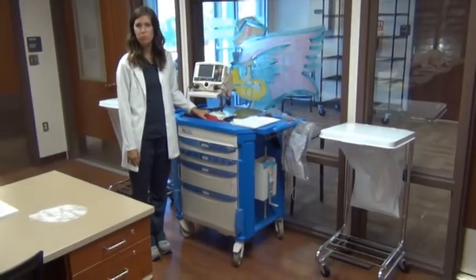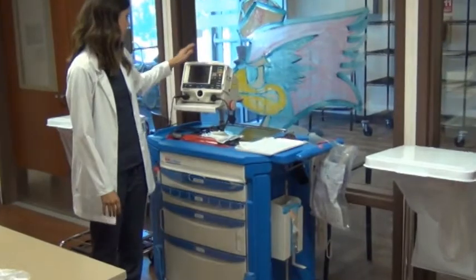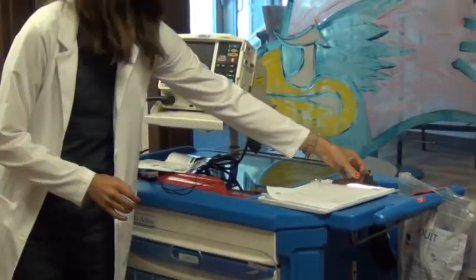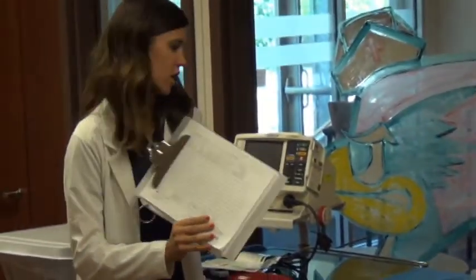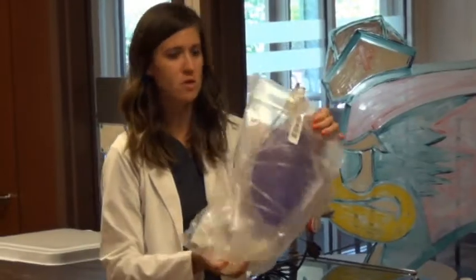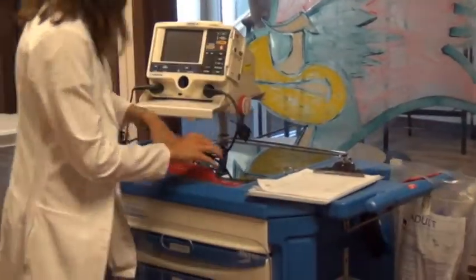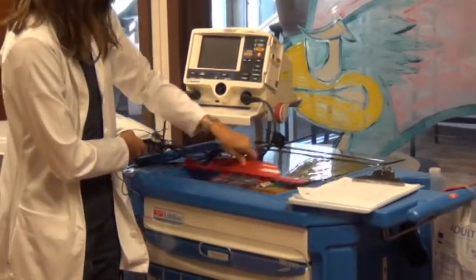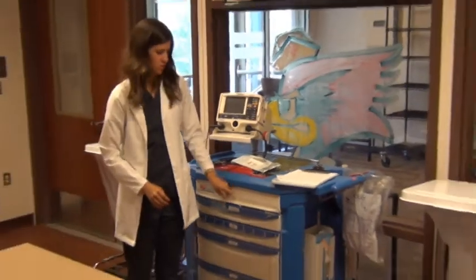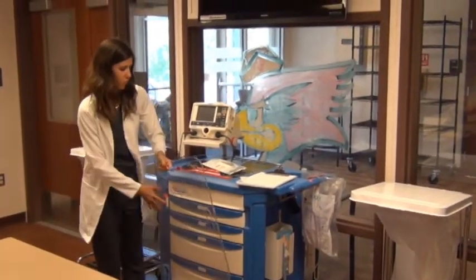In the event of a code blue, we have crash carts at either end of the sim hospital. On it, there is the defibrillator with pads, the code sheets that you would write all of your documentation on, the ambu bag for giving your rescue breaths, and all of the medications that you will need are in this top drawer of the crash cart. Once you roll the crash cart into your patient's room, you'll roll your patient and place the backboard underneath them for compressions.